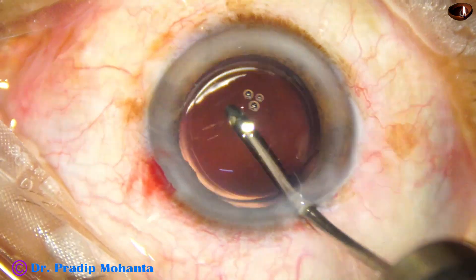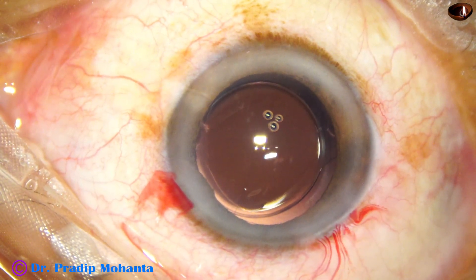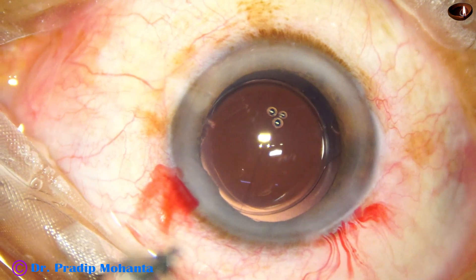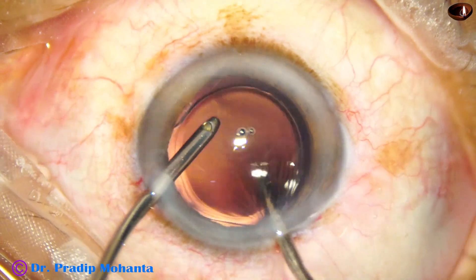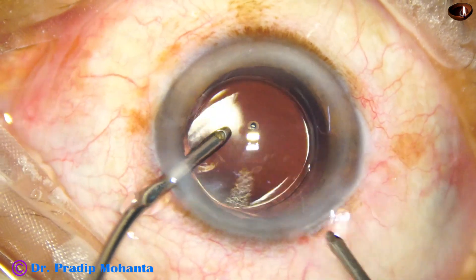We can see some lens fibers protruding from 5 o'clock, so I ask for the aspiration cannula — irrigation and aspiration. I remove the fibers by aspiration, keeping the anterior chamber formed by the irrigating cannula.